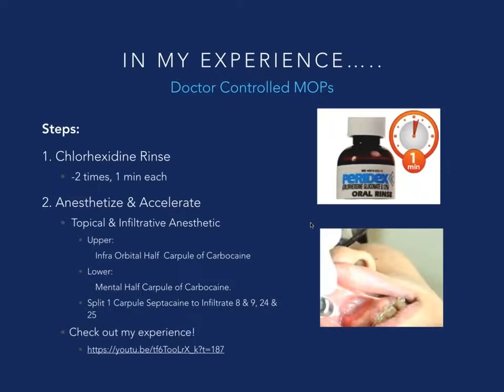We use local anesthetic. Obviously you can use topicals or a strong topical anesthetic, and that's how we originally started providing Propel. So we would use a really strong topical. We would give it minutes to set in, and it did a great job with the tissue. It did not do a great job at anesthetizing the bone. And when you're going to be putting pressure on the bone and causing some microfracturing of the cortical plate, you're obviously going to cause pressure to be exerted on the roots and the ligaments. So that pressure is what they will sense, or some people will sense.